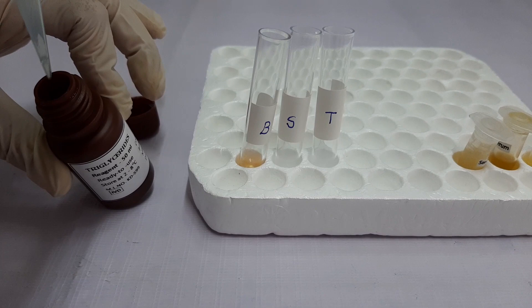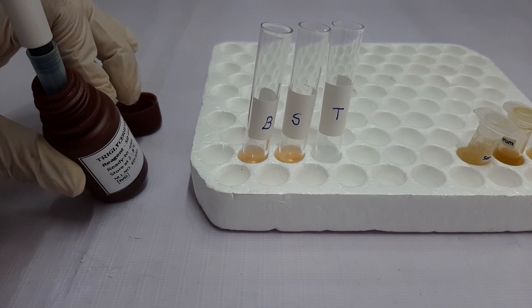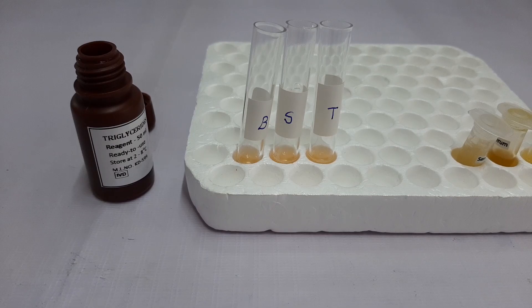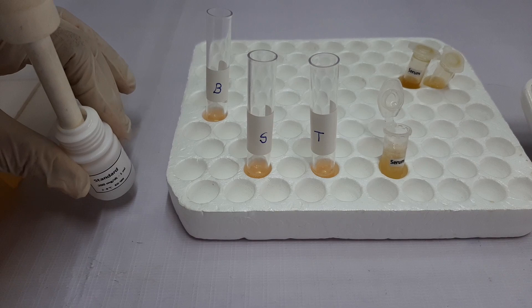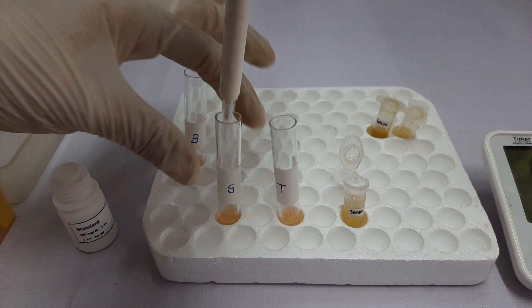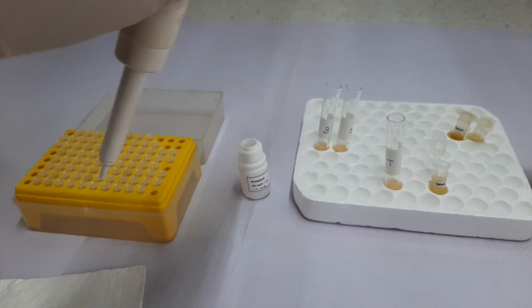Please note that as per the protocol, we have labelled the 3 tubes: the first one for the blank, the second one for the standard, and the third one for the test or patient sample. So now we will take 10 µL of standard, wipe the outside of the tip with a tissue paper, and then add the standard to the second tube labelled for the standard. Mix the components of the tube thoroughly.